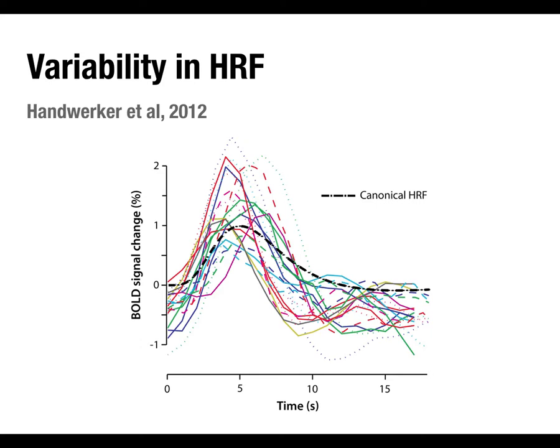But again, if you think about that whole chemical cascade, it could just be that the purple area was slower to recycle the glutamate. Or the prostaglandin release to the capillaries was a little slower, and the capillaries reacted more slowly, or there are fewer capillaries in that particular part of the brain compared to another part. There are lots of different reasons why these things could be different that have nothing to do with the neural activity. And that's really important to understand because fMRI is so indirect.